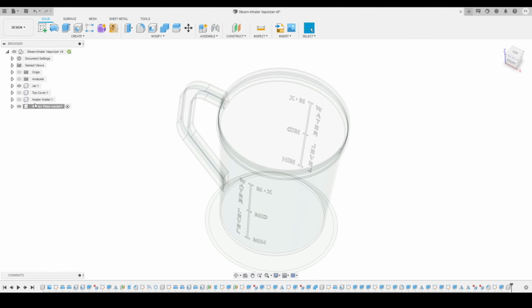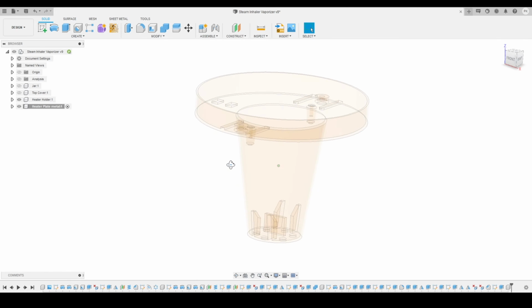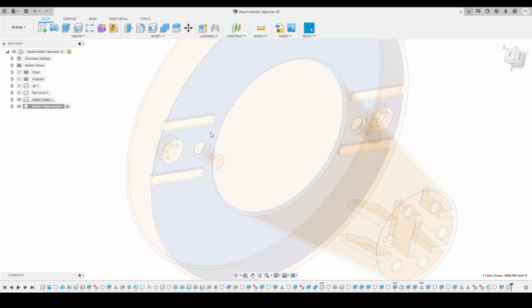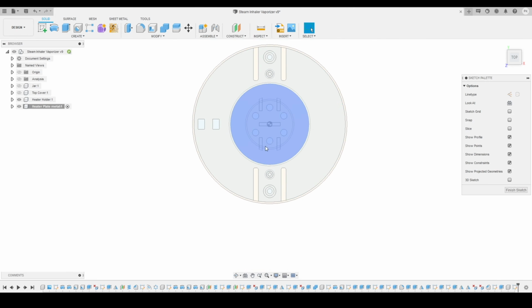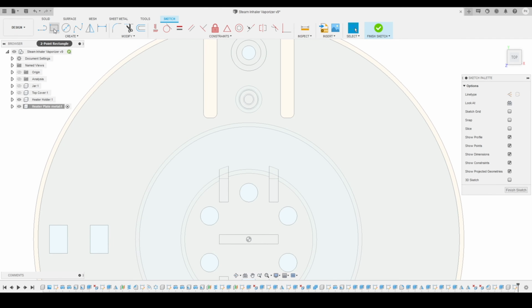Now I will just turn off the other two components, or maybe the jar components also. I will just keep this heater holder turned on, because here we are going to use some reference measurements. Now I will select this face as a sketch plane and we'll click on create sketch, the sketch to create for the heater plates. And now I am going to use some features from this heater holder component. So for this I'm going to use the project tool.